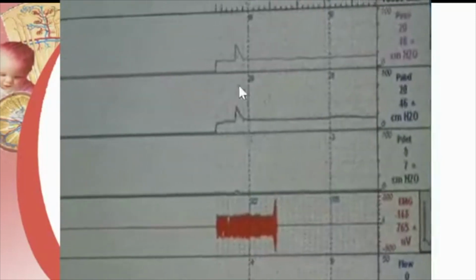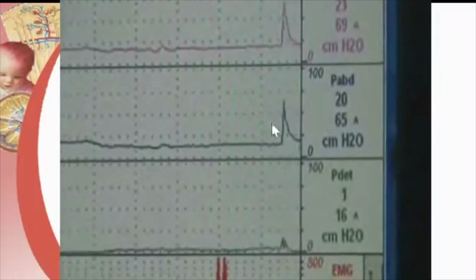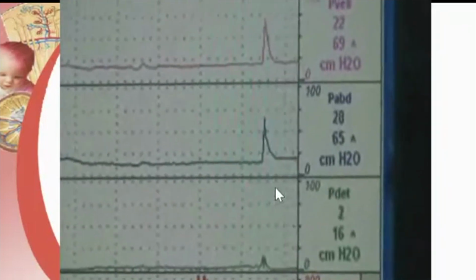He has now become 14, 15 years old, and his creatinine has gone up, and he is a pre-transplant candidate on dialysis. So there's a good subtraction. This is like an adult, so he can cough at your request. And in this patient, again, see, good subtraction is there when he coughs.